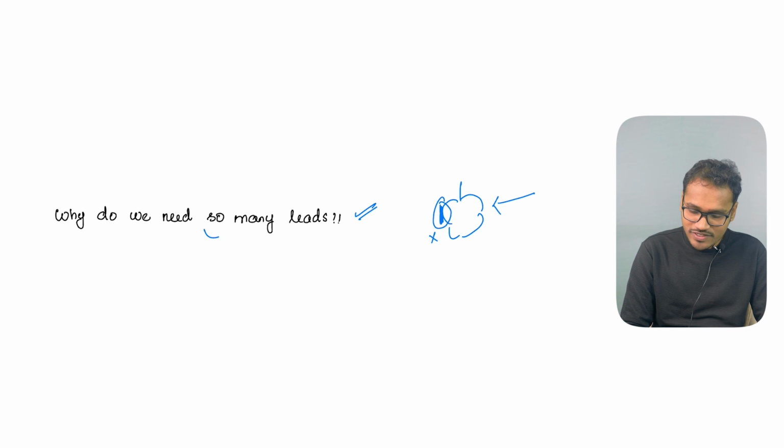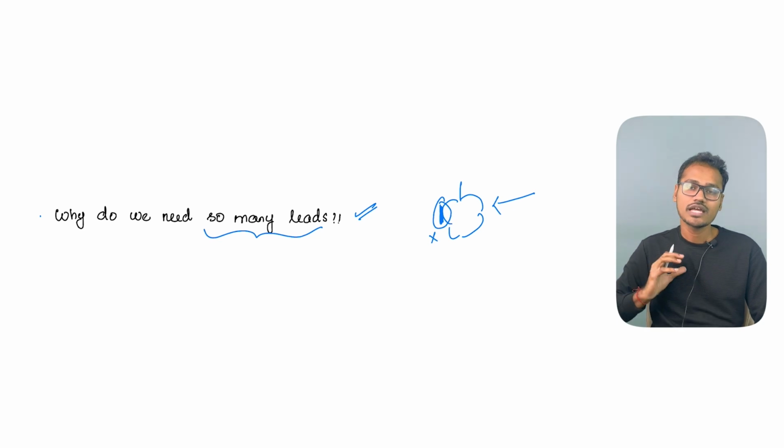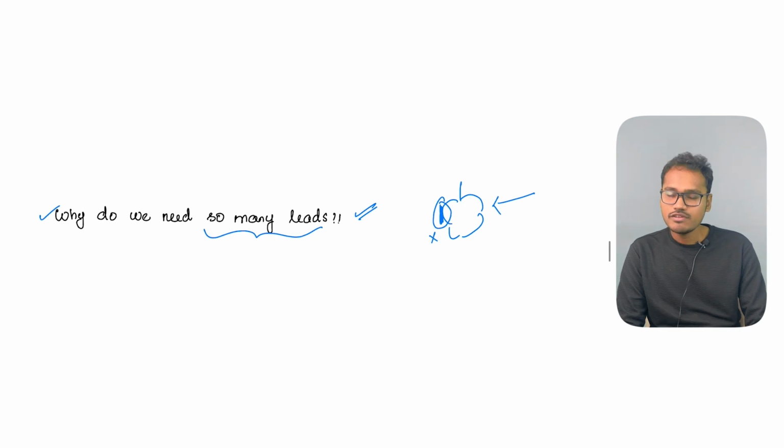So to capture various different angles, we need to have multiple leads. So the same heart's activity, we are trying to capture it with various different cameras at a different angle to understand and observe the various different changes occurring in various different walls of the heart. So that is why we need multiple leads. So we will go one by one now.